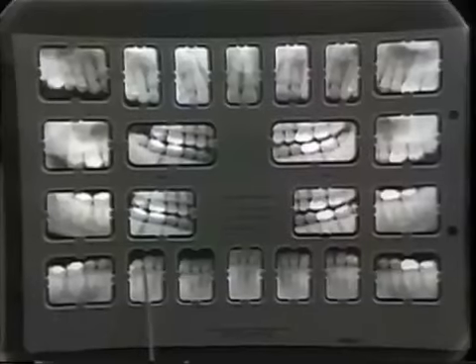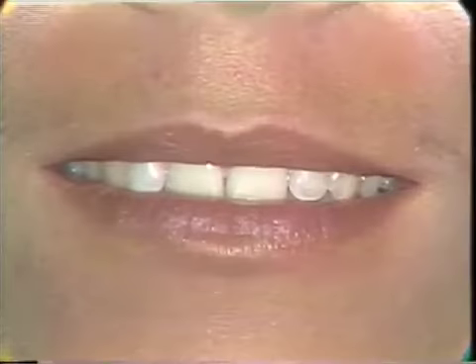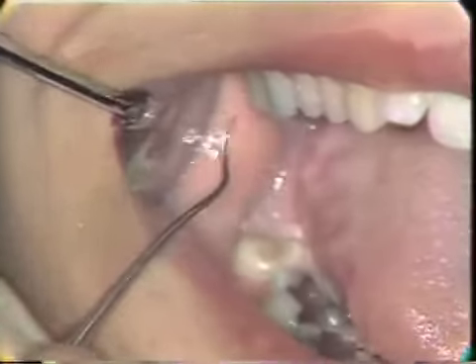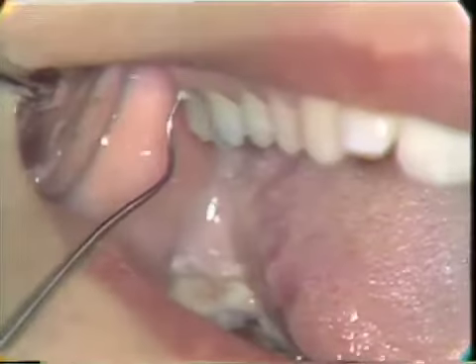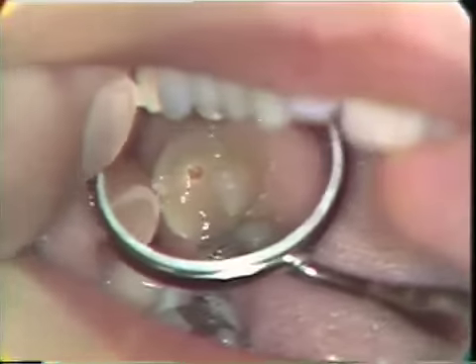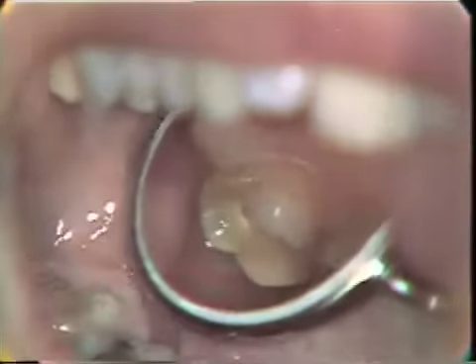At this point, we can refer to the patient and do an examination of the teeth themselves. We will start the examination in the upper right quadrant. The first thing to do would be to check one surface of the tooth number 2, the buccal surface, continue to the occlusal surface, and here we can see that the restoration in tooth number 2 is a composite with a breakdown through the occlusal and over to the lingual surface.